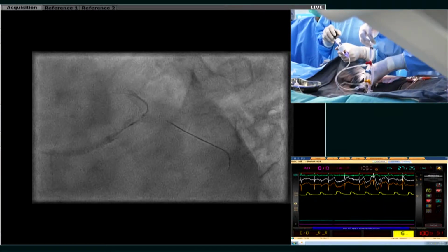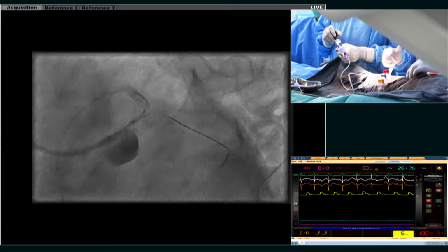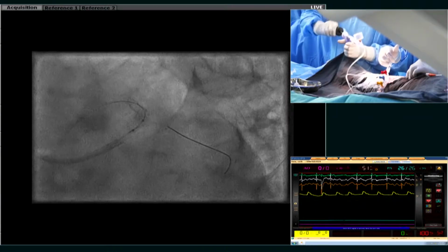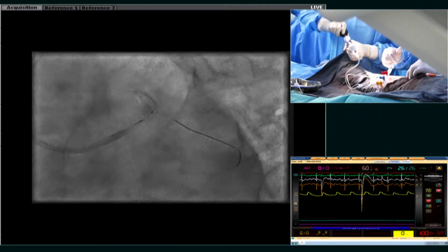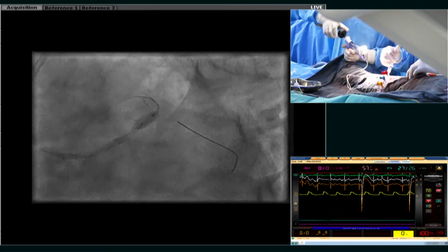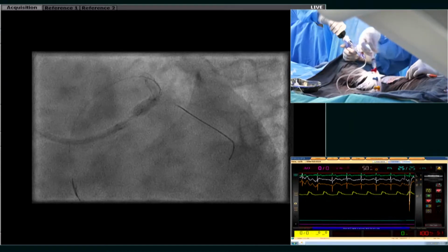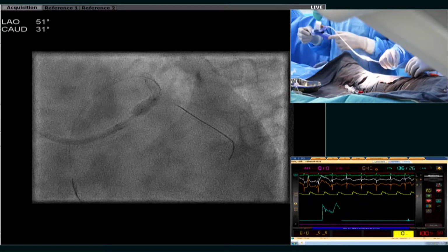And I think it's very important to know the position of the POT. As you know, I think that is something that you all can discuss over there. So go up again, 6, 8, so that we just have a shoulder right at the ostium of the circumflex to push the circumflex struts into the circumflex ostium. 10, 12, 12, 12, 14, 14, down. Now let's do the OCT once again and see what we have achieved with the POT.